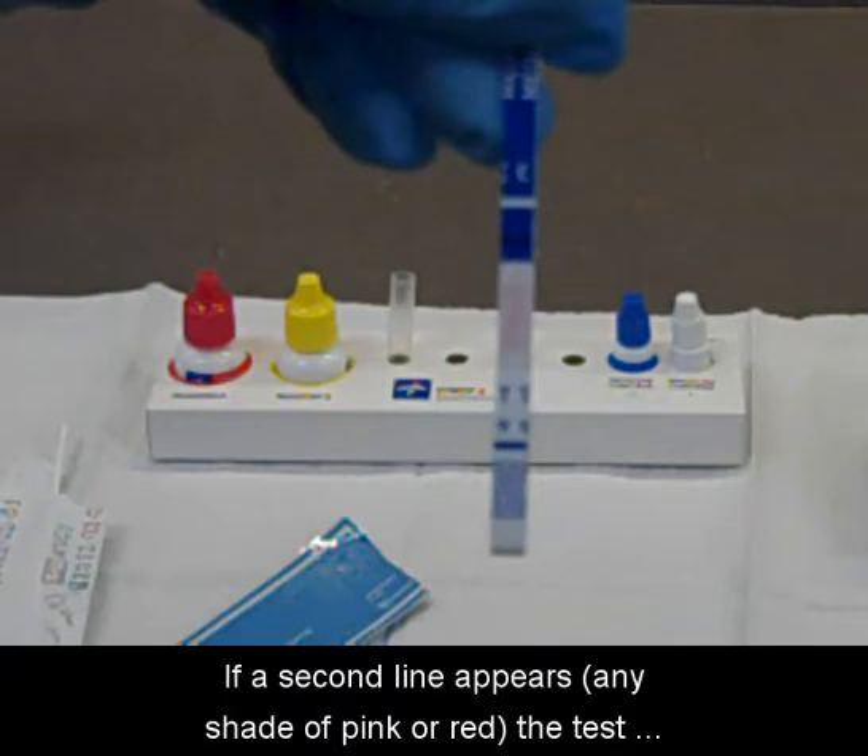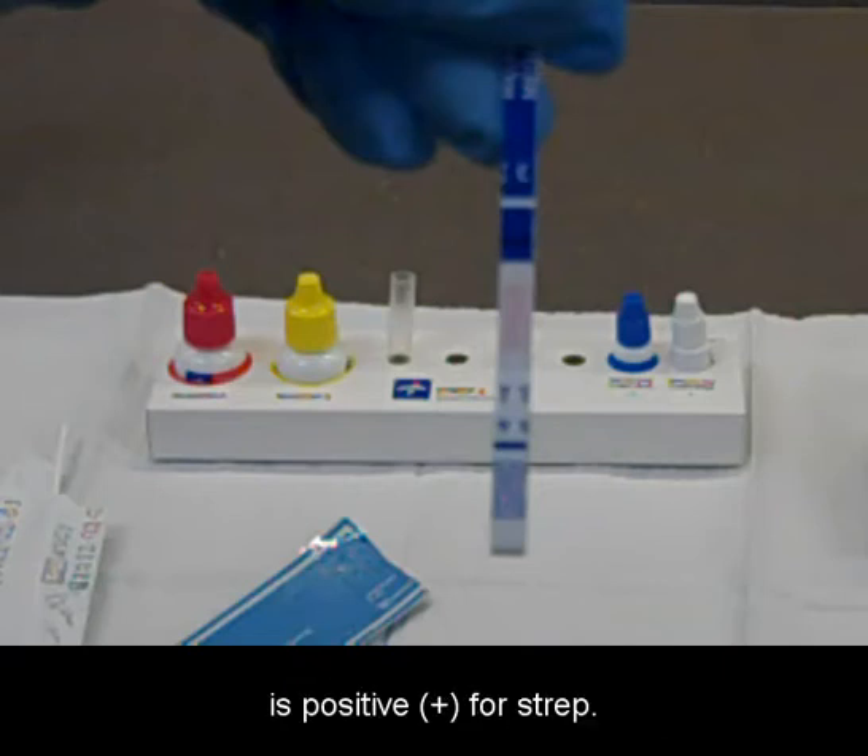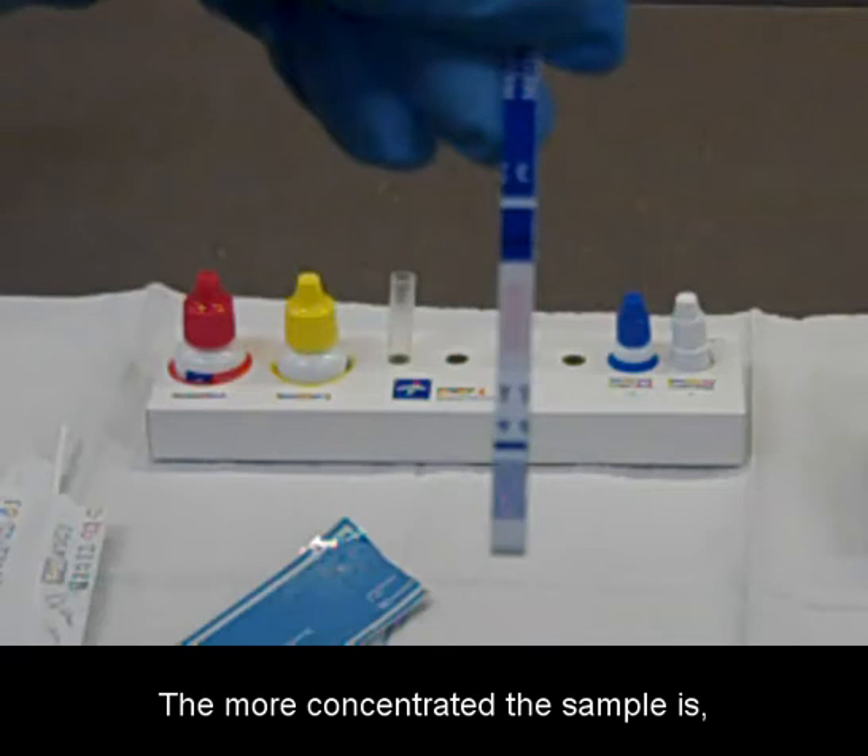If a second line appears, any shade of pink or red, the test is positive for strep. The more concentrated the sample is, the darker the second line will be.